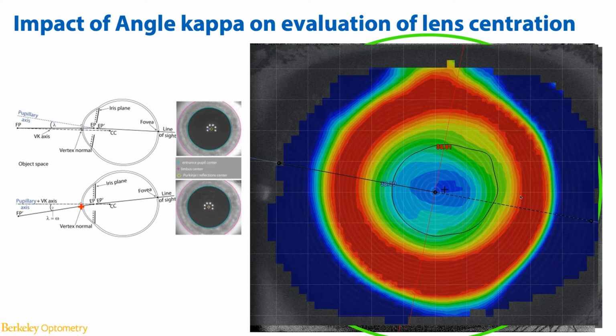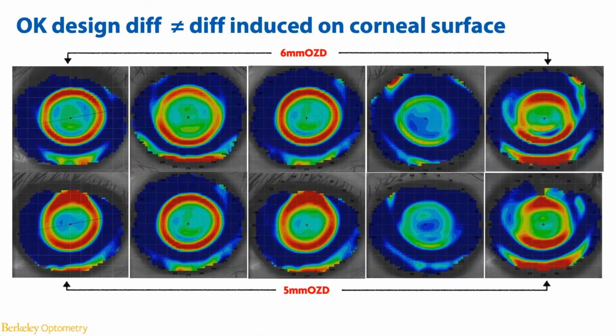Yeah, setting expectations with both the patient and parents is so important. And that actually brings up a good question as well with the 5mm optic zone diameter size. Did your patients in the clinical study notice an increase in glare, or would you be concerned about glare and halos increasing in patients in this design?